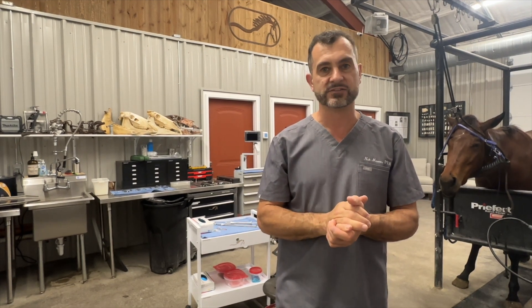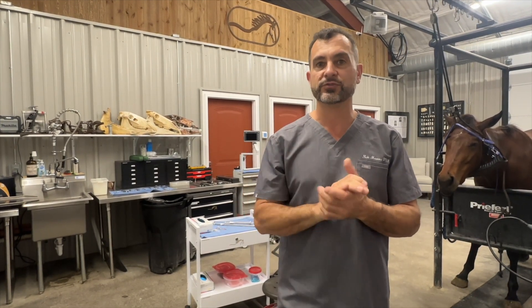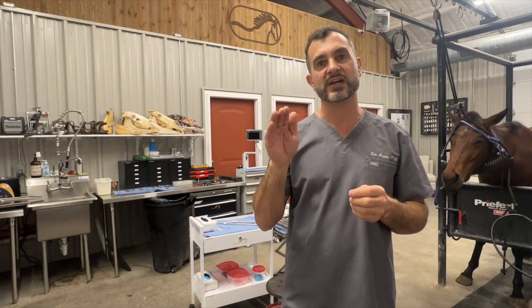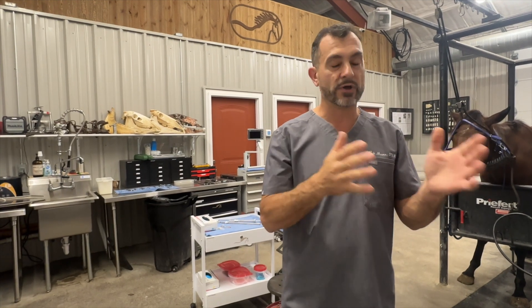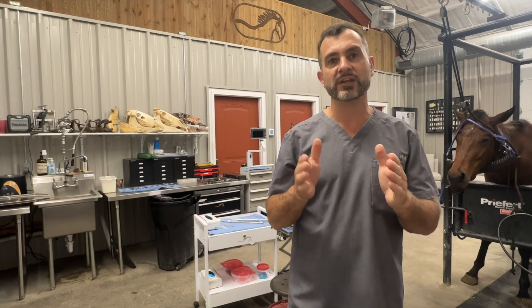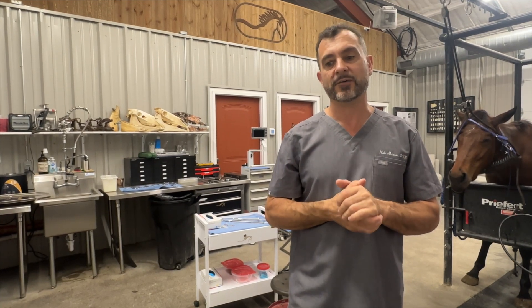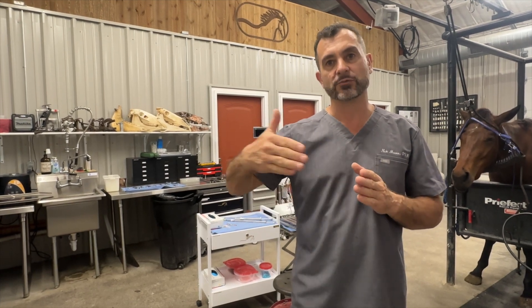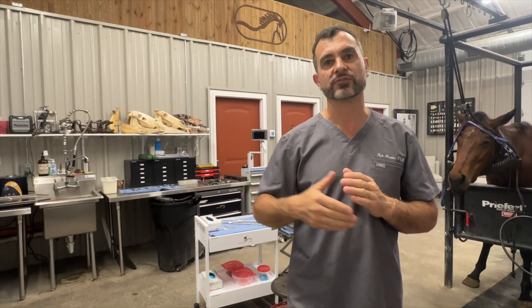I don't want the horse chewing a lot during the procedure, and I don't want to be slow. I need to be fast and efficient — not rushing, but minimizing surgical time. There are many ways to do that: part of it is experience, but a lot of it is having a good stepwise process, the right instruments, and the right training.